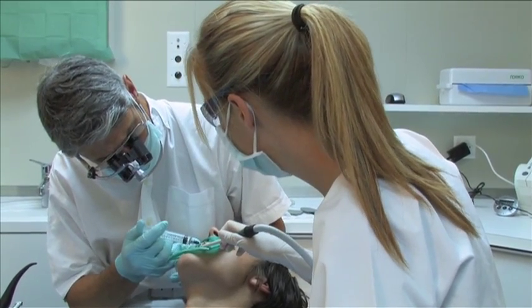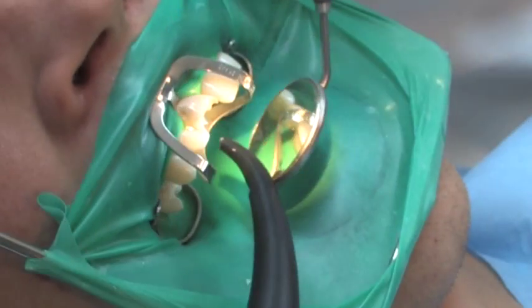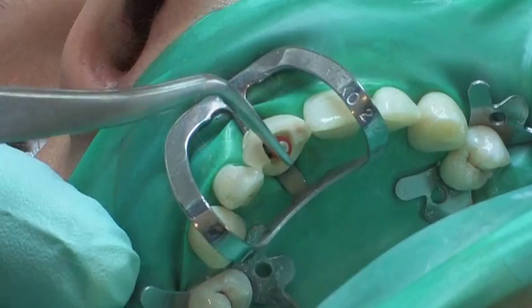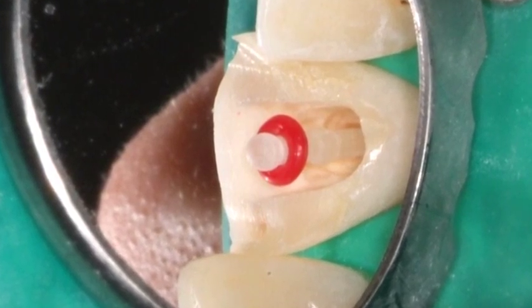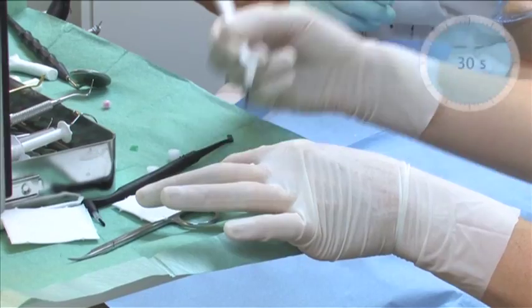The root canal is rinsed using sodium hypochlorite. The corresponding light-transmitting glass fiber reinforced ParaPost Fiber Lux post is trial-seated and inspected for proper fit inside the root canal. The post length can be shortened as needed based on the clinical situation.